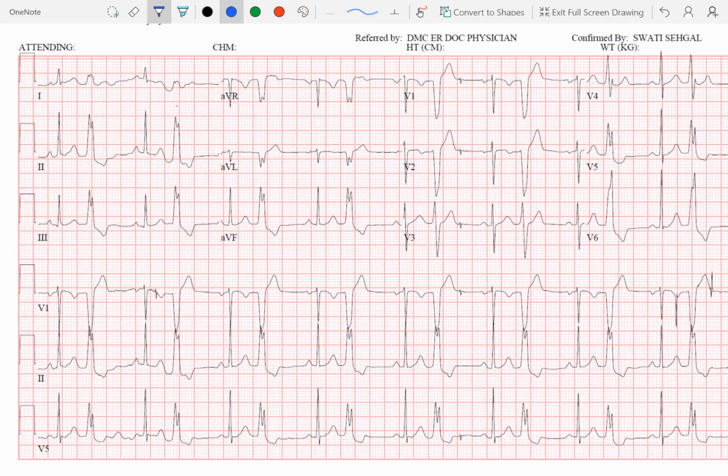And here it is positive. And so again, a free wall origin would be a lower risk of... Well, the septal origin would be something that is typically seen in your right ventricular outflow tract PVCs, although you can have free wall origin too. Yeah. A septal origin is what you typically see in the right ventricular outflow tract PVC.